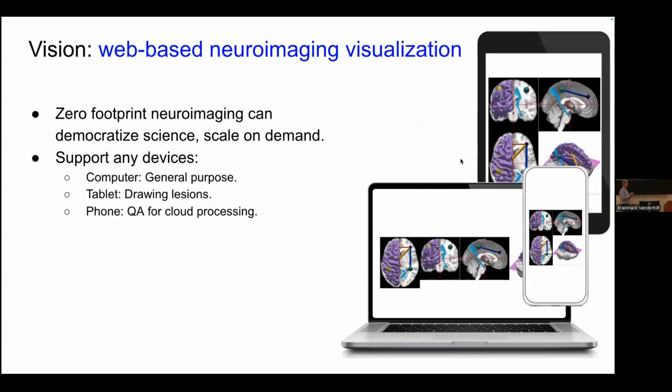And beyond that continuous evolutionary pressure, there's now revolutionary pressure that we now have cloud compute. We want to deal with huge data sets that are going to use cloud resources. And we have these capabilities of all these devices that tablets might be particularly good for drawing lesions on. If you find something unusual, you might want to send it to someone who might be about to catch a flight and you'd like to have them look at it on a phone. So web technologies are a great opportunity, but they're also kind of a challenge.